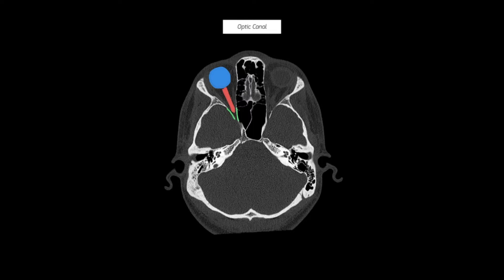These are axial images through the level of the skull base. You'll note that these are bone-enhanced acquisitions to help accentuate the bony quality and bony texture. I've annotated one half of the image so you can refer to the other side for reference.